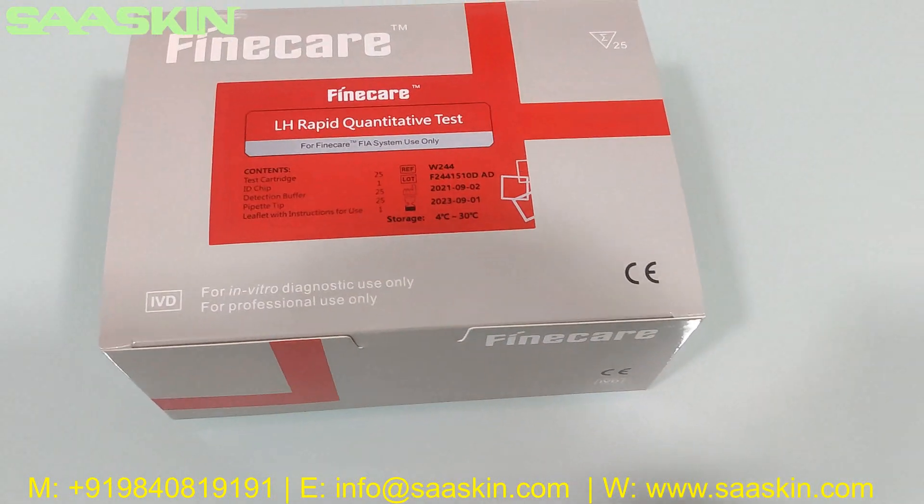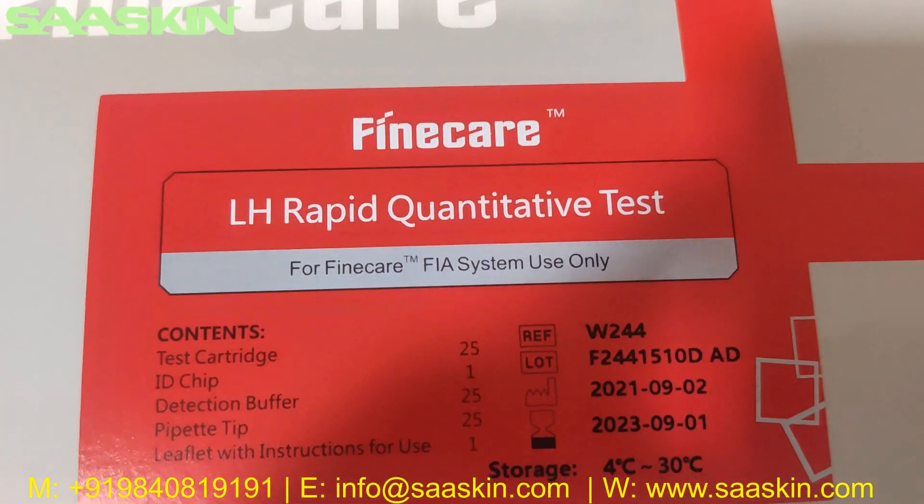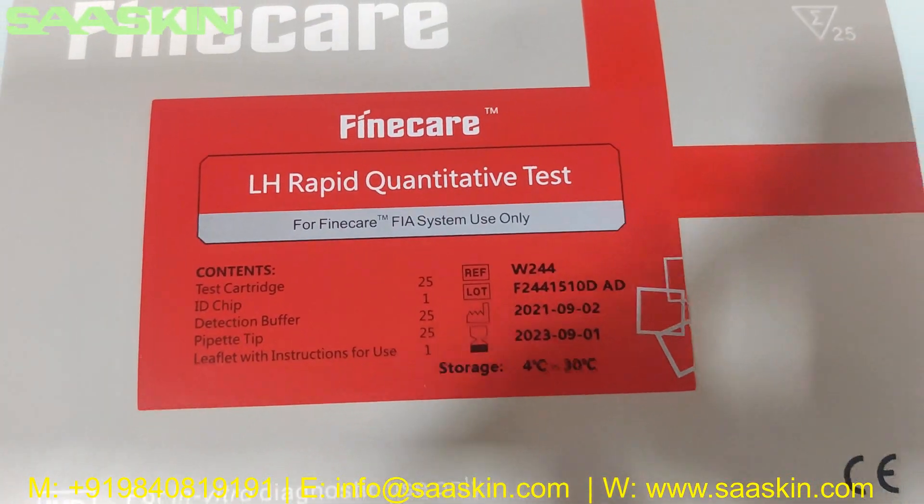Hello everybody, today we are going to see the unboxing of the Fine Care LH Rabbit quantitative test, to be used in the Fine Care FIA system.